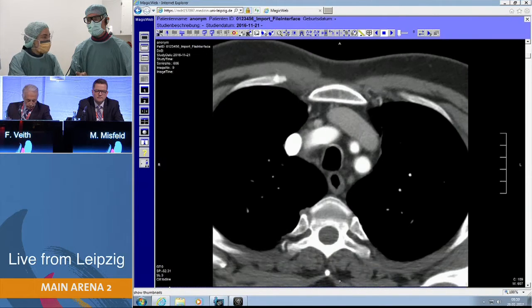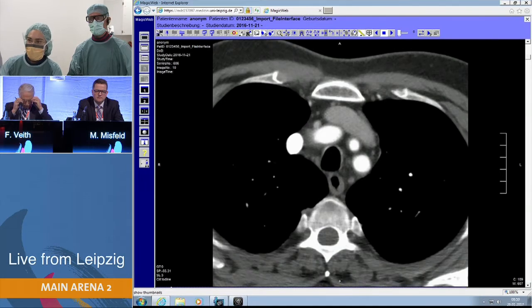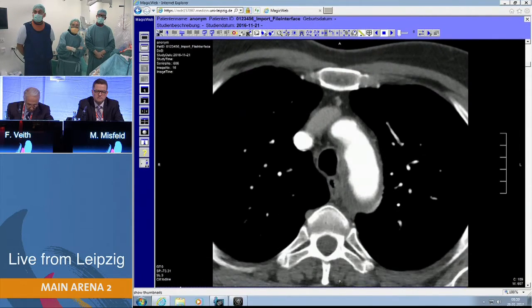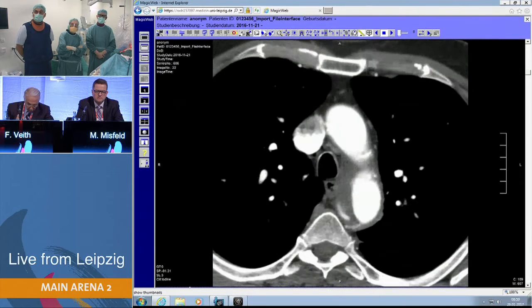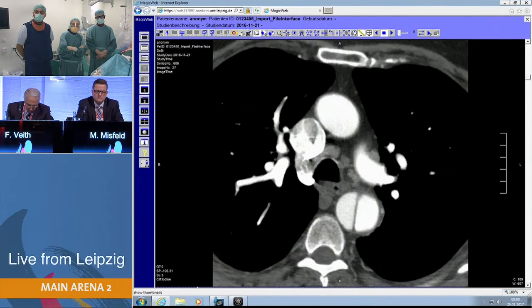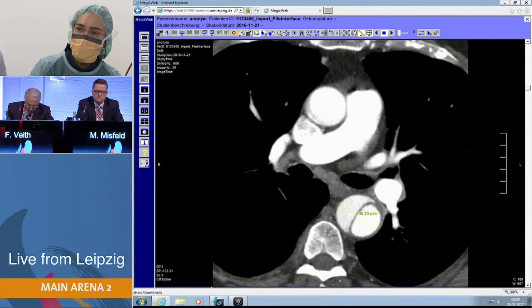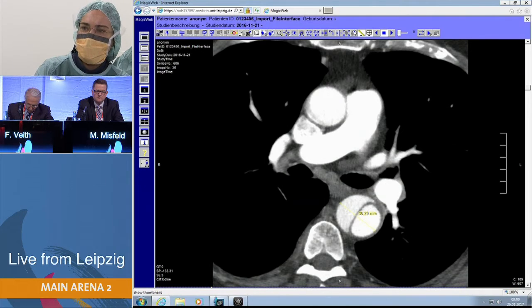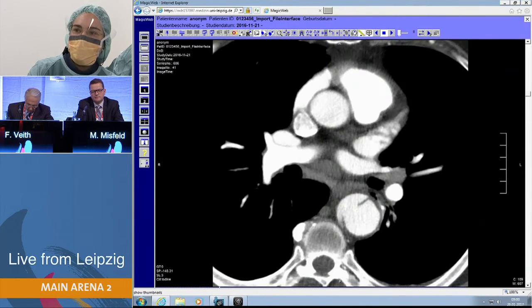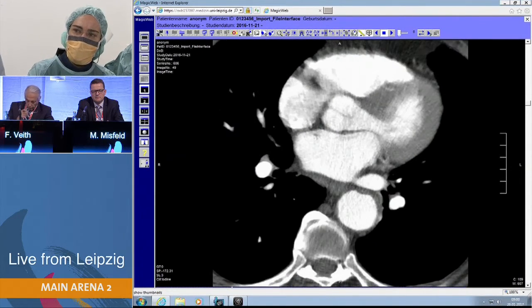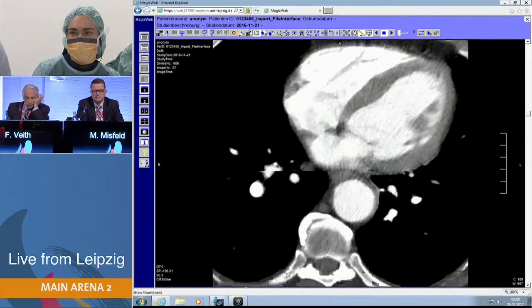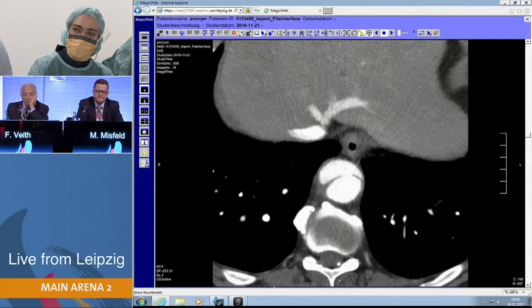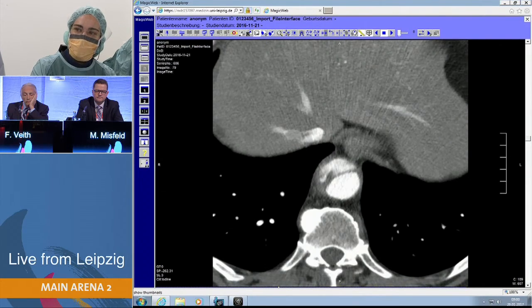Here you can see the live CT scan running. You can see the supra-aortic vessels and some intramural hematoma. You can see the dissection further down. When the patient first presented, the diameter was about 3 centimeters; now it is approximately 36 millimeters. You can see a large entry tear of the dissection, but no re-entry — it's like a blind sac. Going further down, you can see another large entry, again without a re-entry.